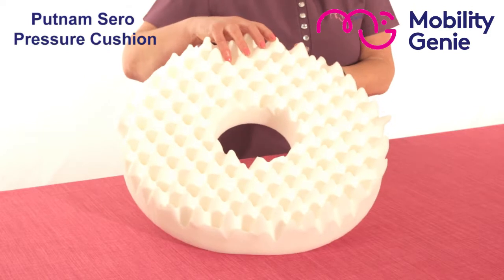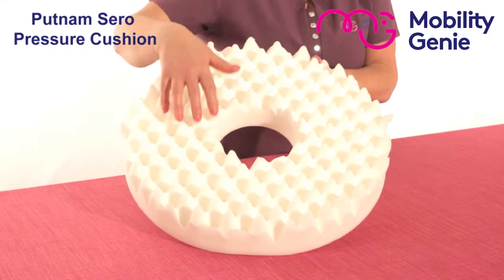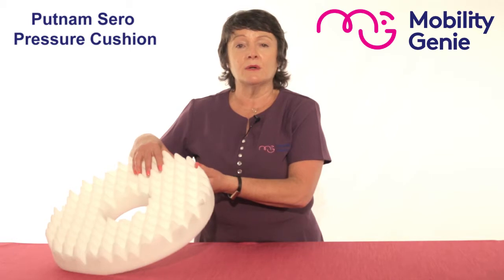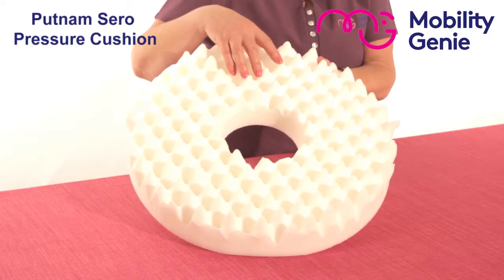In the zero pressure cushion, the top part of it is nodule, like the bottom part of an egg crate. This helps to stimulate the blood circulation and also allows the air to circulate freely, which helps in healing and also helps to prevent pressure sores.